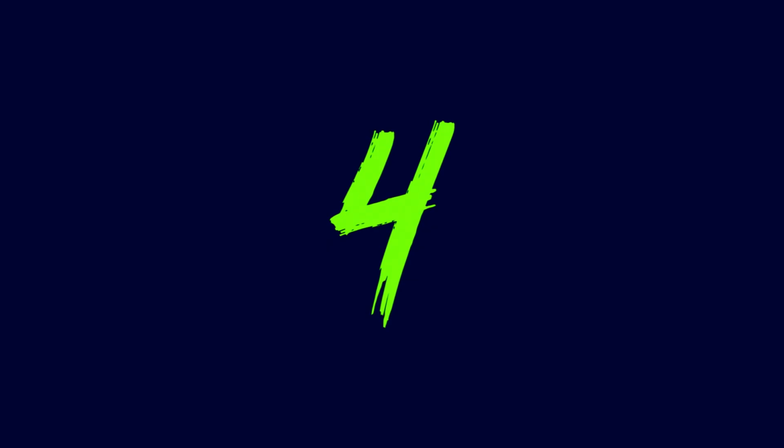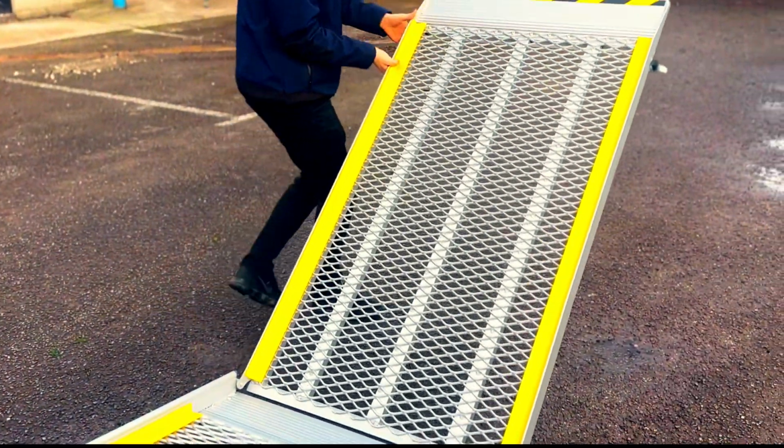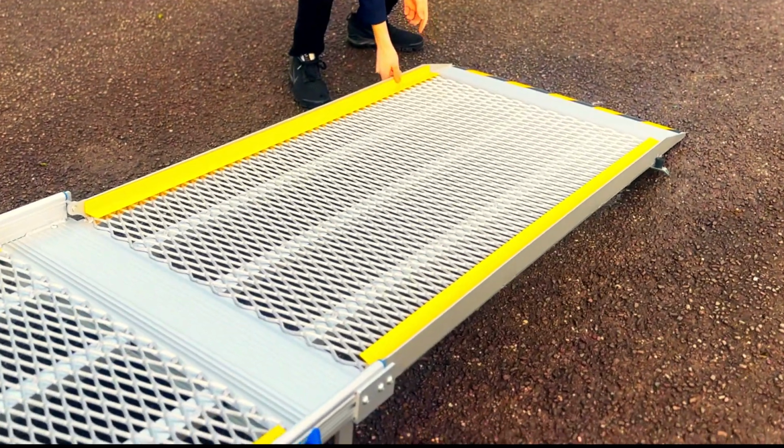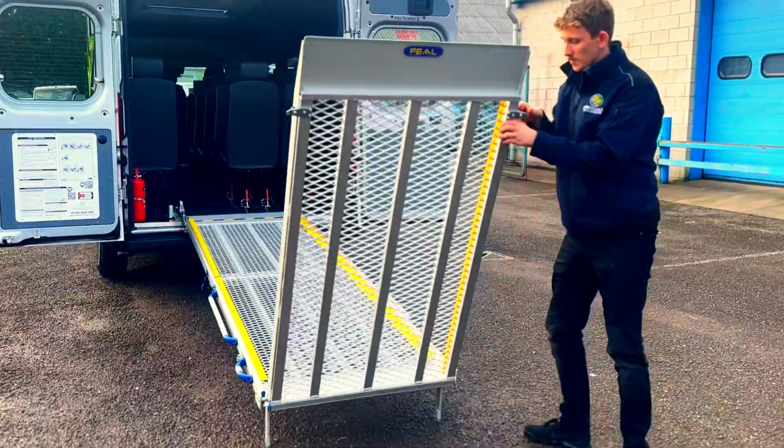Step 4. Now unfold the last section of the ramp completely, ensuring it is fully extended and resting securely on the ground. Step 5. When you're finished using the ramp, simply reverse these steps.